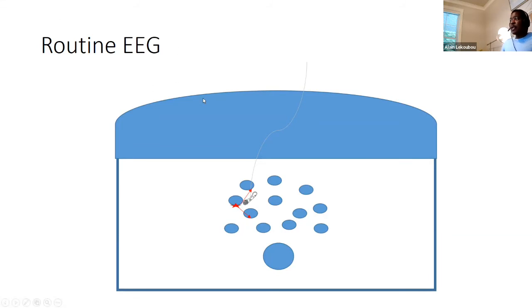Okay. So for the stereo EEG, you really want to get your microphone through a hole in the roof, right where you think it's coming from. Once you're here, if you tell someone that you had a microphone here and you heard the wrong note being played here, I'm more convinced that this is actually coming from this area of your brain. Okay, making sense? So the stereo EEG is really the way of precision.